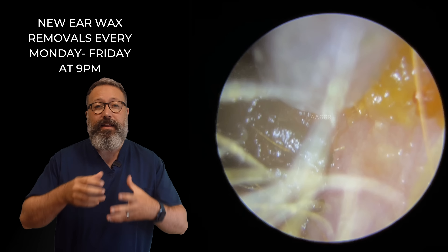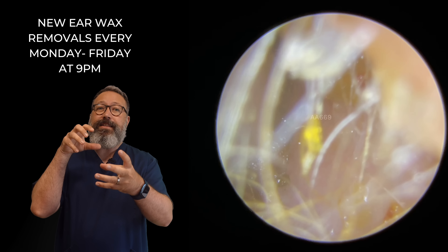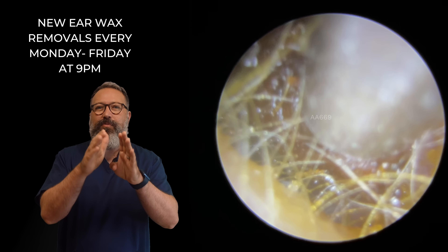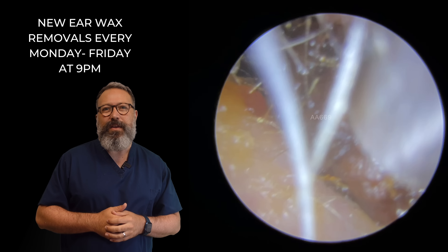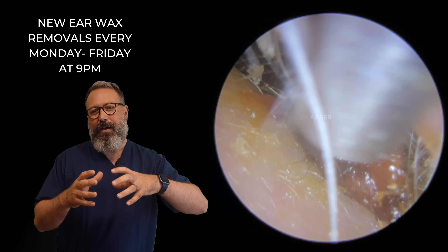As we start to bring this out of the canal and get it to the entrance, because the entrance collapses down when we take the suction tube out, the entrance then collapses back down again. It tends to break these longer pieces of wax away. You can see what I mean just here. So we've got the suction tube through, but now that canal entrance has started to collapse down on top of that piece of wax.